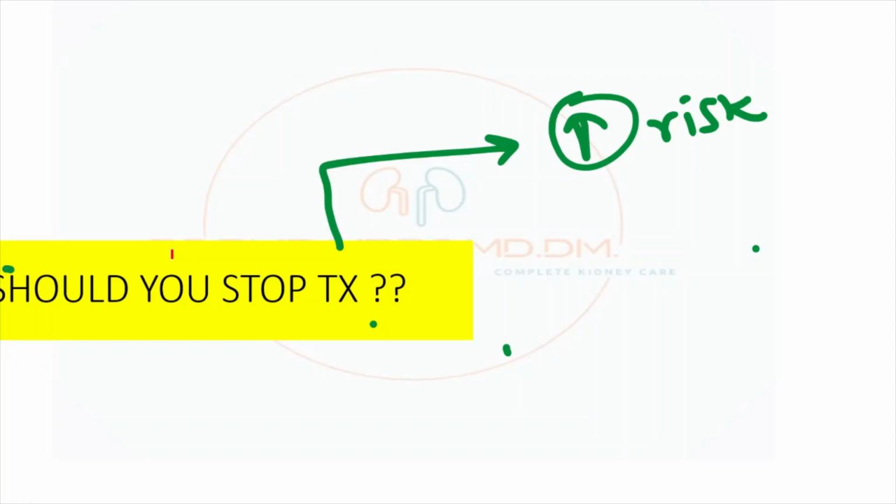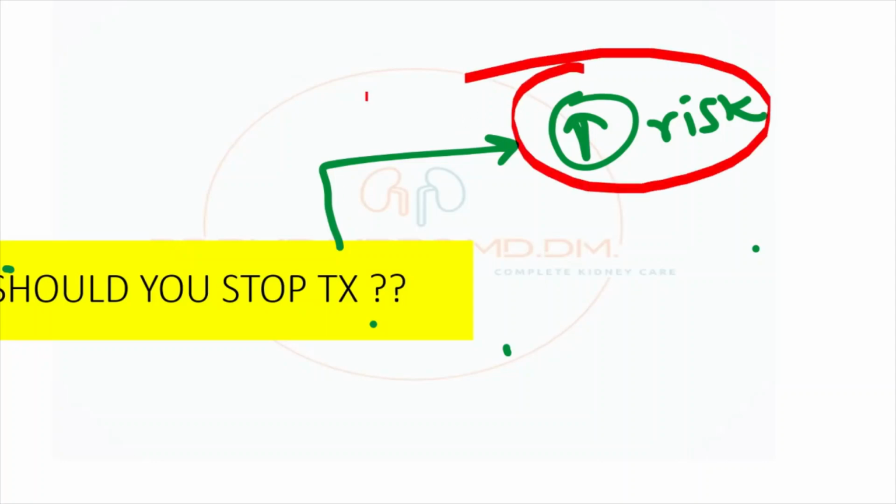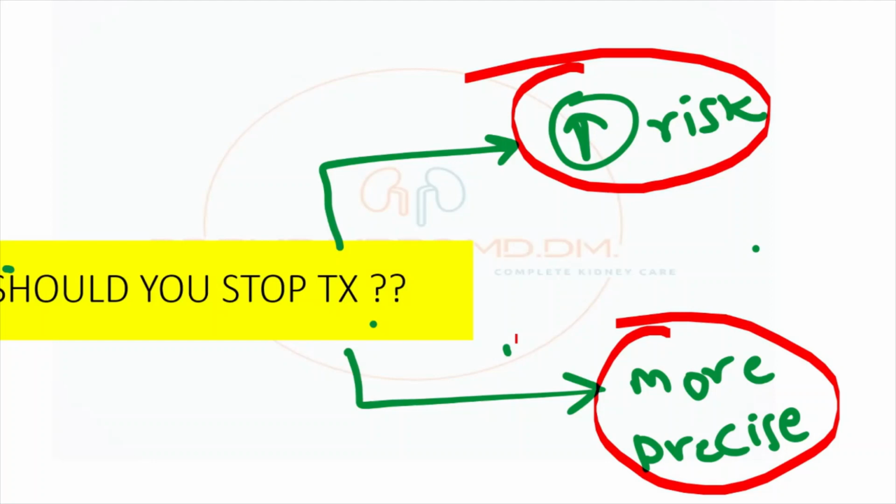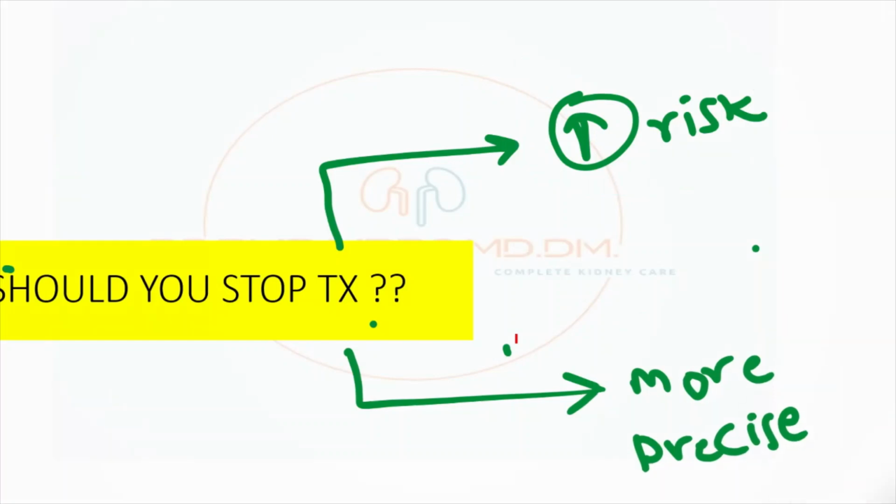Take another donor. I will discuss in the Luminex report interpretation also how and when to reject the donor. So if only CDC is negative and flow cross match is positive, the patient is at increased risk of rejection. We have to search for the particular antibody and proceed with the more precise test, that is single antigen bead or the Luminex assay.